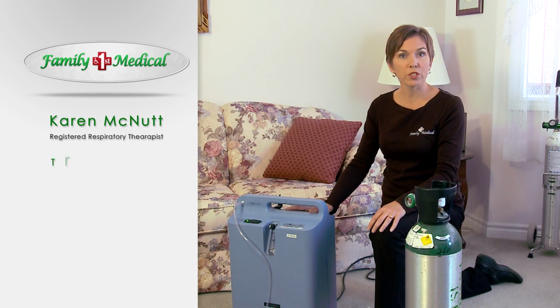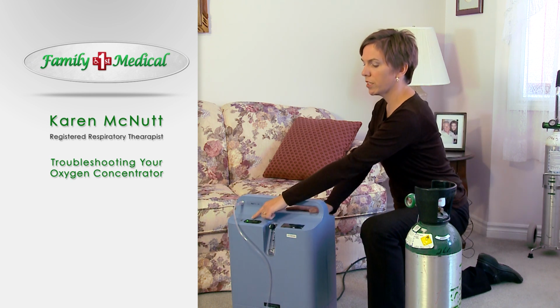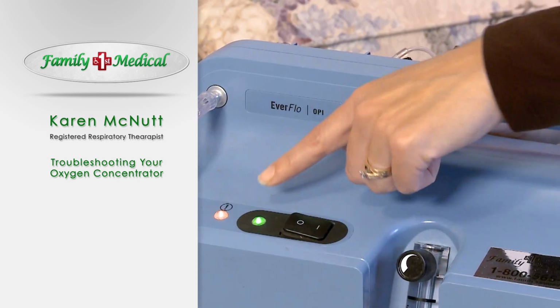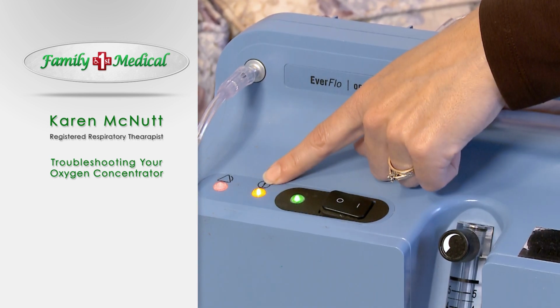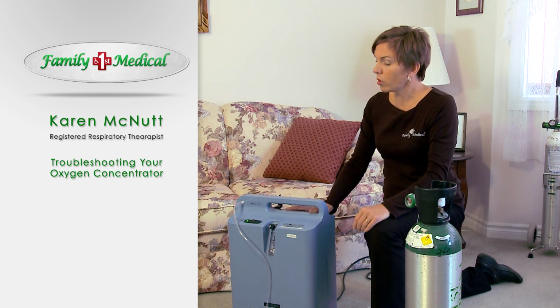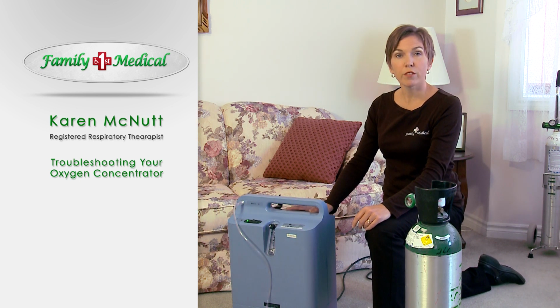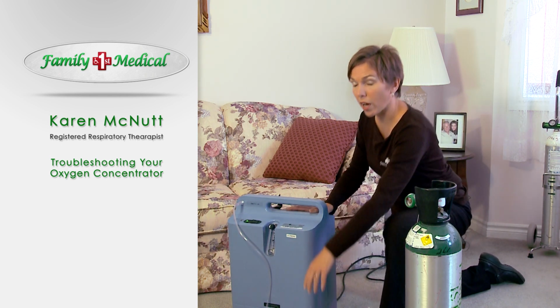First, we'll start with troubleshooting your concentrator. When the concentrator is working normally, you'll see a green light located on the front of the unit. If there's a problem with your unit, then you'll have either a yellow light or a red light and an audible alarm. When you're troubleshooting the concentrator, the first thing that we need to do is decide whether or not it's the machine that's causing the problem or if it's the plastic supplies.